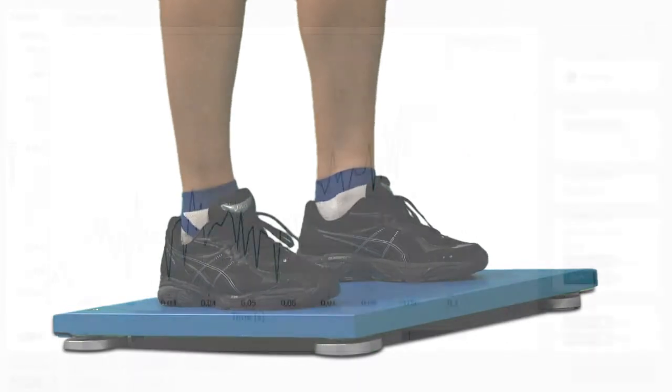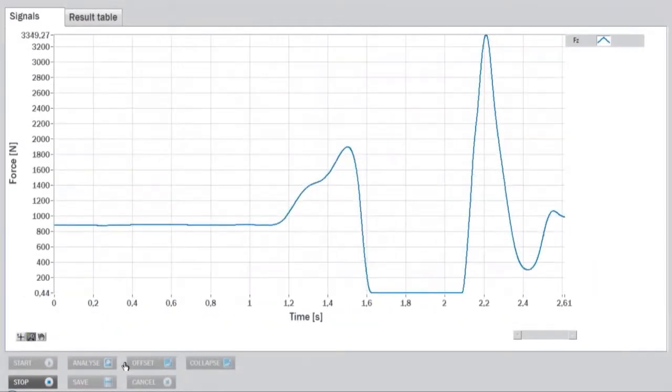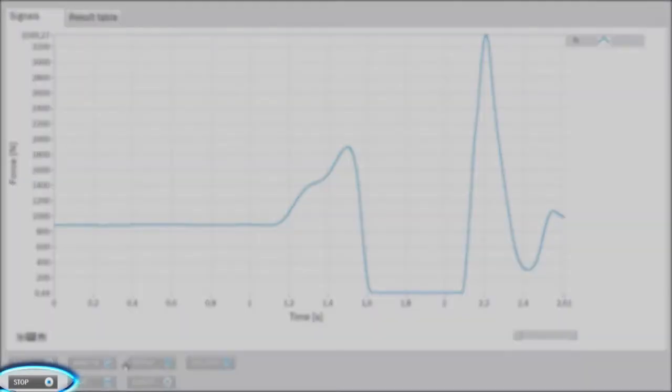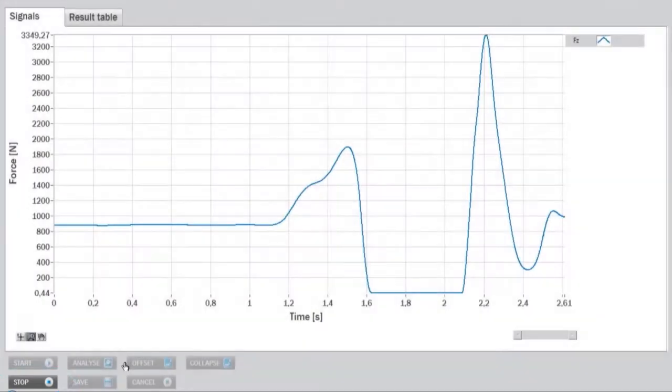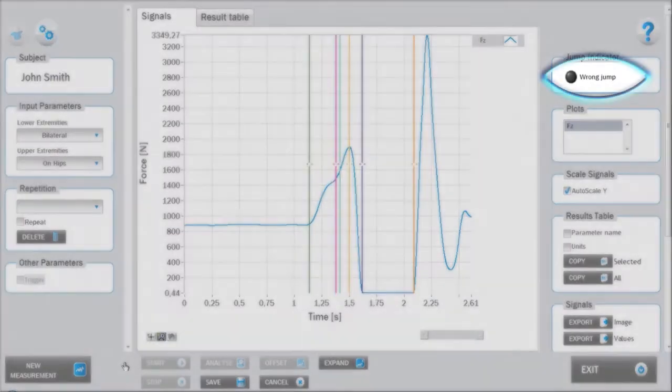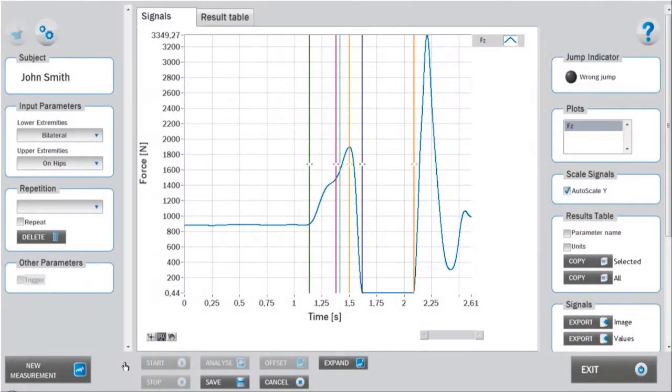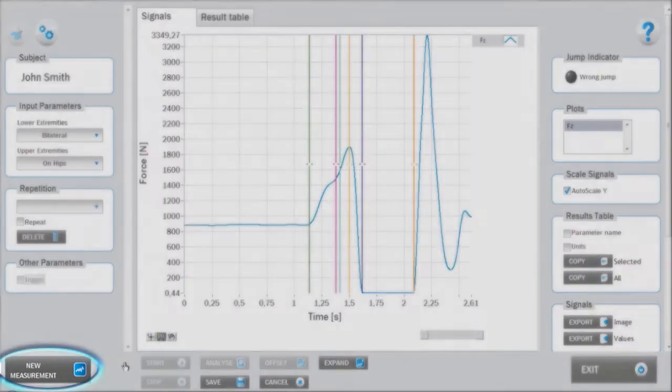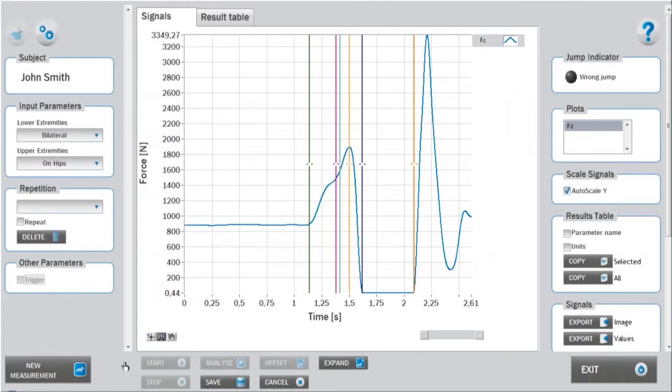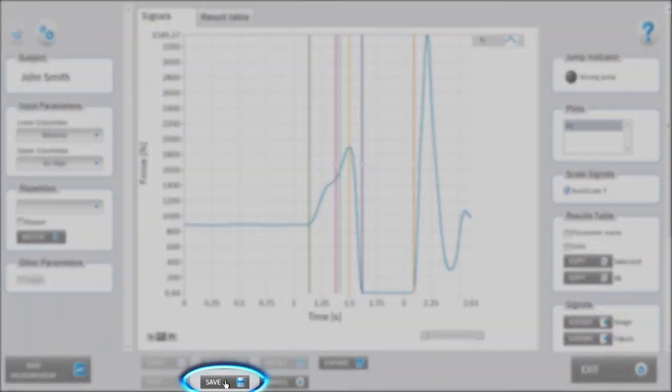The measurement stops automatically after landing. It can also be stopped manually by clicking the stop button in the lower panel. If the jump was not correct, the jump indicator in the right panel will indicate a wrong jump. The measurement can be repeated by clicking on new measurement, thus not saving the previous repetition. If you are satisfied with the measurement, you can save it.